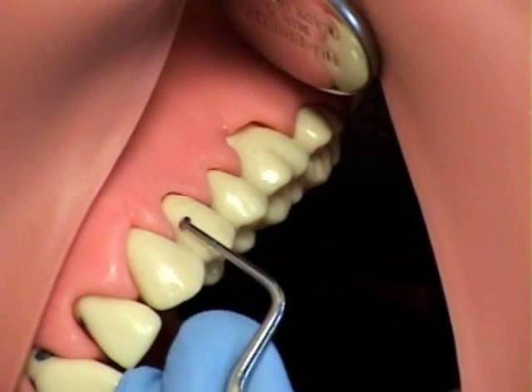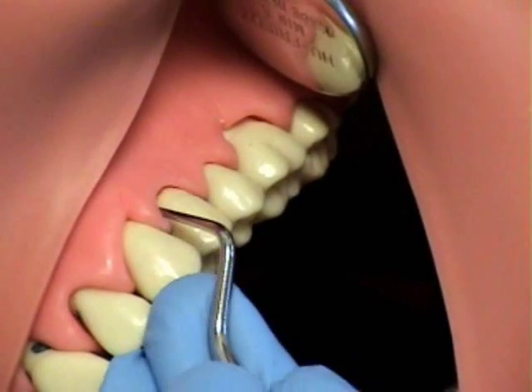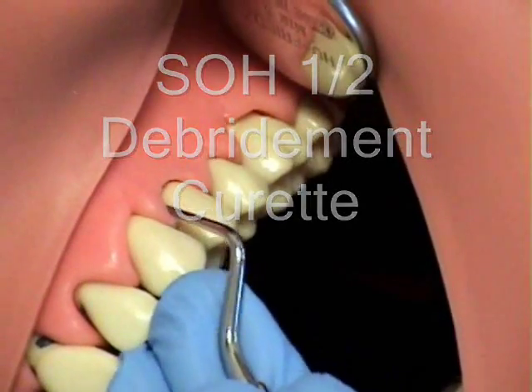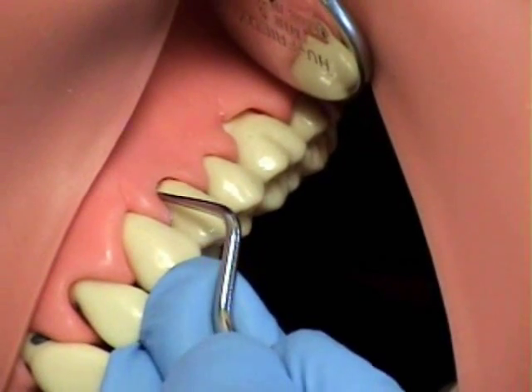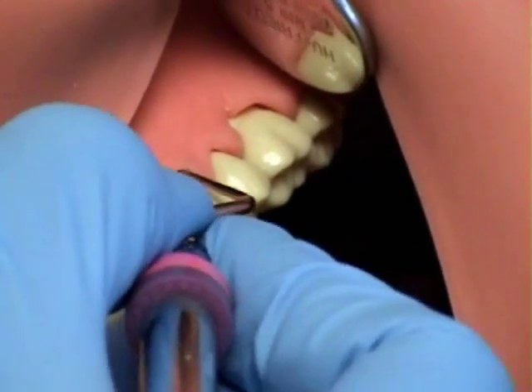The buccal lingual debridement curette SOH12 has a long terminal shank that can extend 15 millimeters in length and allows access into deep, narrow periodontal pockets. That is the instrument Ms. Johnson is using currently. It also allows the instrument to be used with an exploratory stroke to evaluate the root surface.